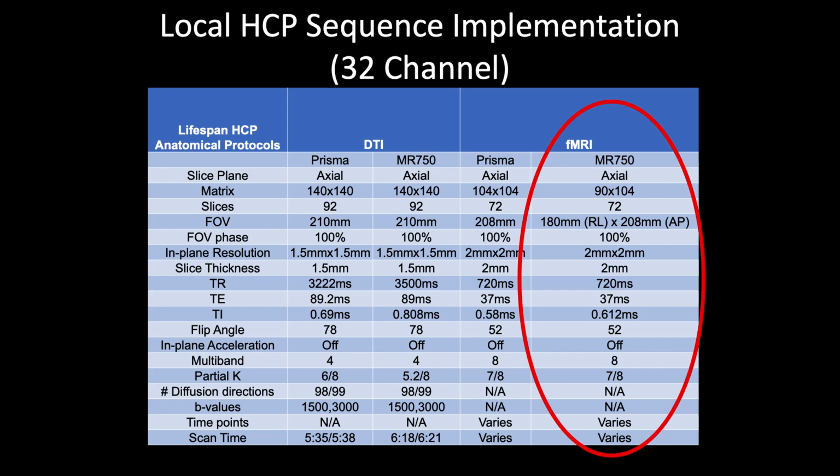So if you look at the far right panel, you can see that our parameters largely match up pretty well with what the HCP has proposed. These are a little bit different than what you've heard about for ABCD. Are you familiar with that project at all? Yeah? Okay. Which also uses a similar approach in terms of their data acquisition.